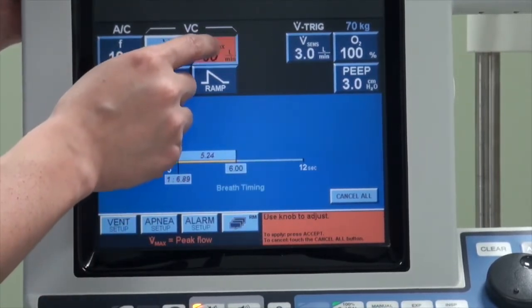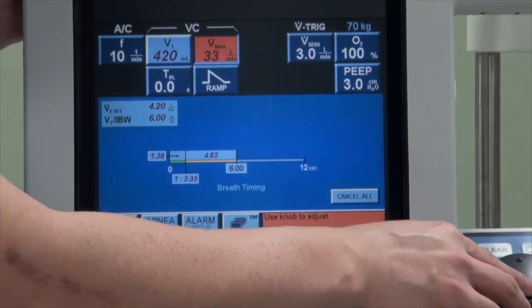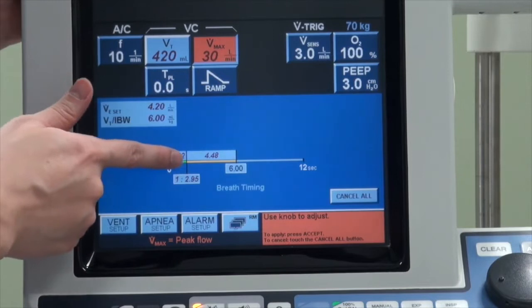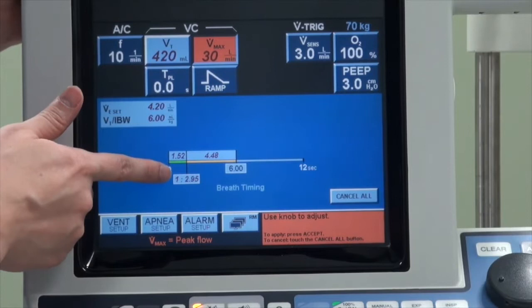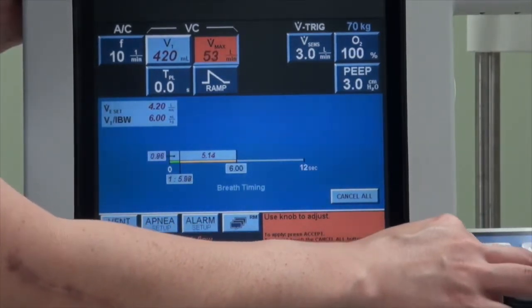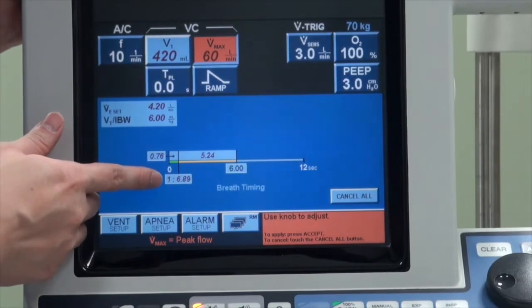You will notice that when you change the tidal volume, frequency, and flow, the I:E ratio will actually change. For example, if you want to deliver the breath in a very slow flow of 30, it takes a long time to reach the target volume — the inspiratory time becomes 1.52 seconds and expiratory time 4.4 seconds, giving an I:E ratio of approximately 1:3. But if you deliver the breath much faster at double the flow, the inspiratory time is shortened, giving a lower ratio of approximately 1:6.